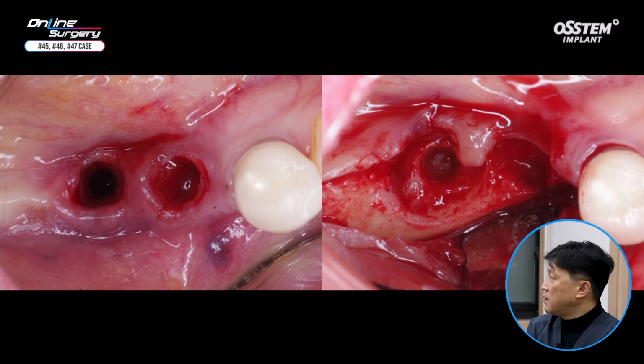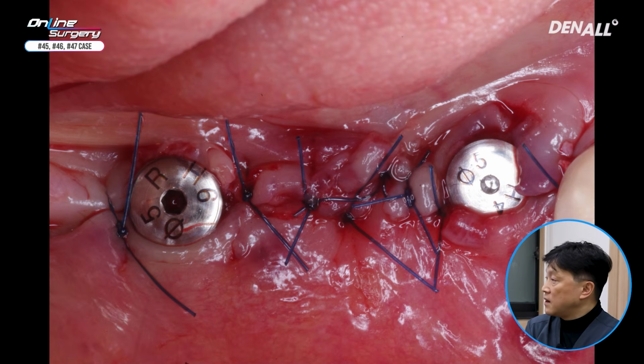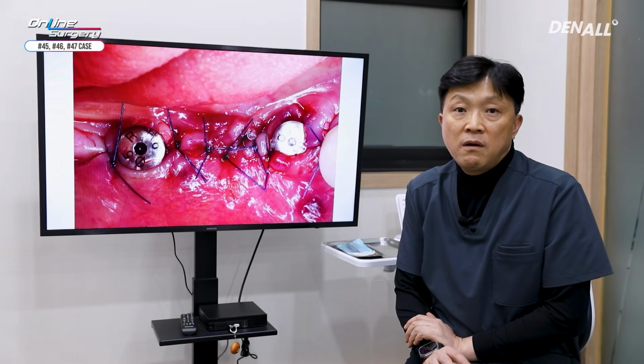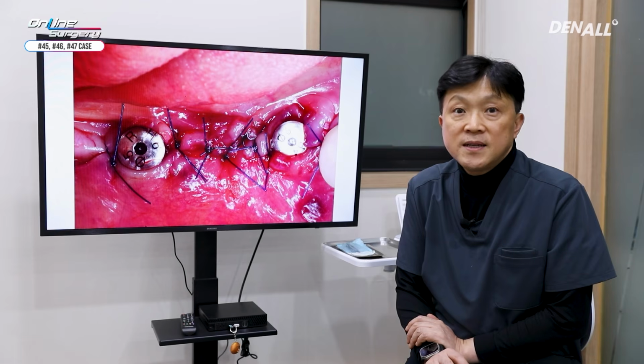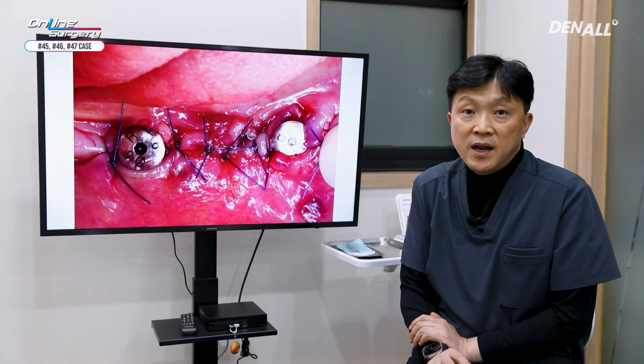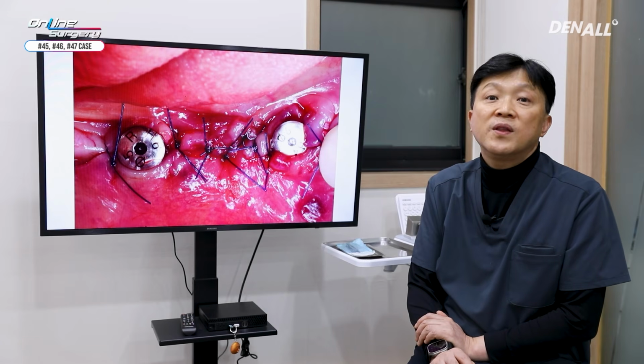After removing the implant, a flap was opened, and this is the status after completely getting rid of the granulation tissues around it. By using OneGuide, 3 implants were placed. As checked in the video, I used 3-wall OssBuilder for number 45 and OB3 for number 46. So I used a protocol reconstructing the loss of buccal bone plate and lingual plate at the same time.